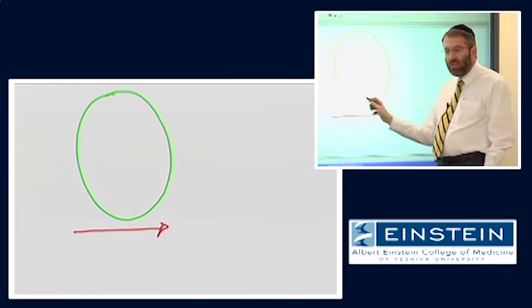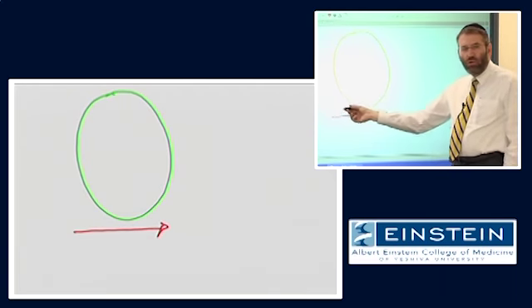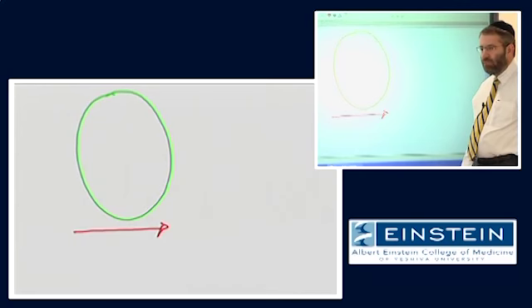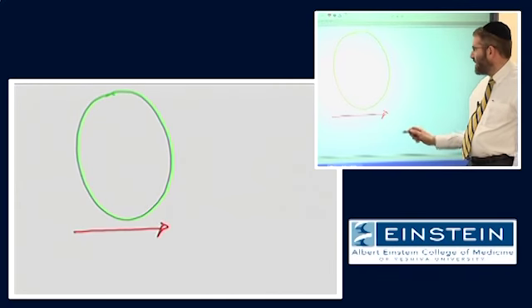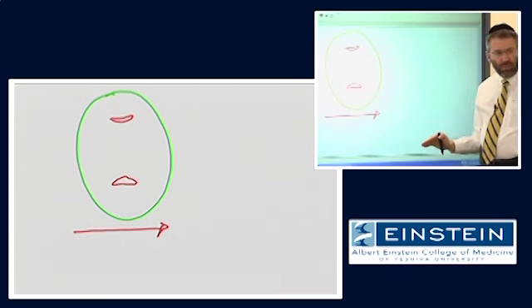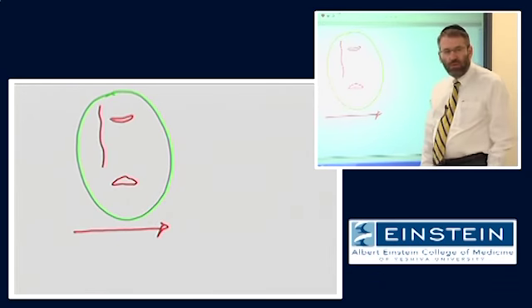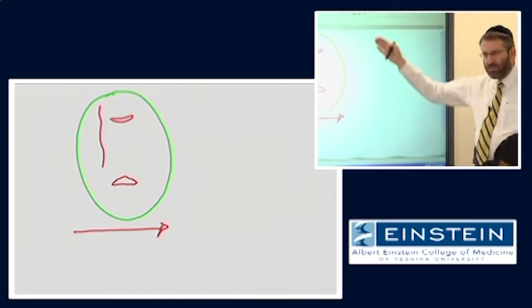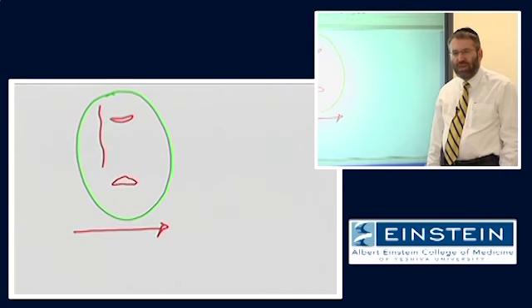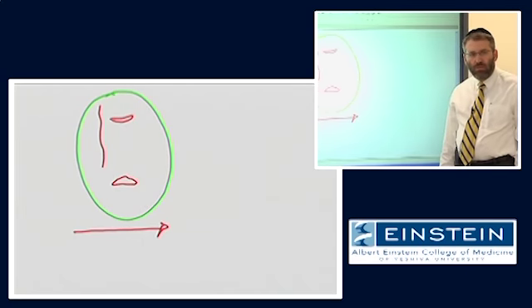Well, there will be attenuation of signal for anything moving along this left-right dimension. So in this image, for example, the corpus callosum will have lower signal amplitude than, let's say, white matter bundles like the superior longitudinal fasciculus that run front to back in the head. If you do that, why is that the case?